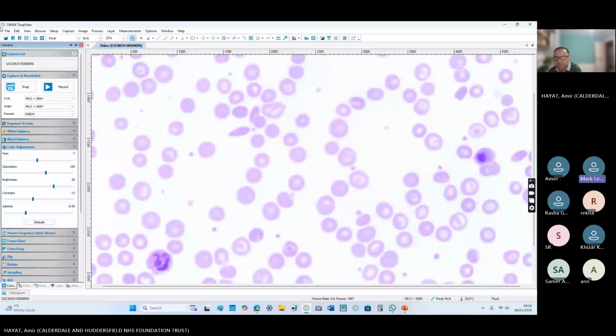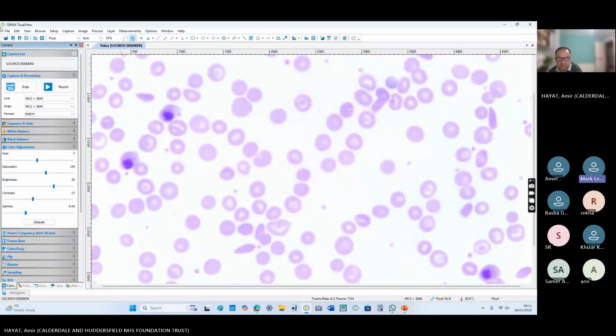Strange looking neutrophil. Anisocytosis. Different sizes. What is this one? Yeah, it's a macrocyte. Now, this one or this one? That could be a spherocyte. These are spherocytes. The patient is sickling. Spherocytes. Yeah.